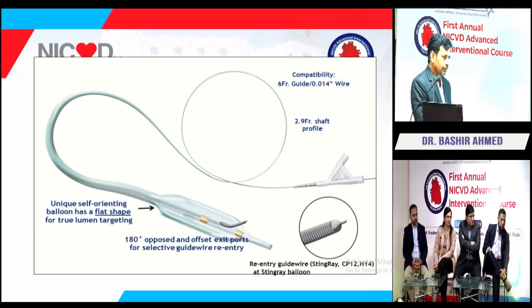If you see two dots which are at two edges, just imagine at 3 and 9 o'clock of the artery, that means you are looking at the artery en face. Now you have to change your angle until you just see one balloon. If you see two balloons, that means you can't stick because you don't know which way to go. Once you see only one, which means the other balloon is on the other side and they're in plane, then you take a retrograde injection, and then you can tell, do I puncture inferior or superior?